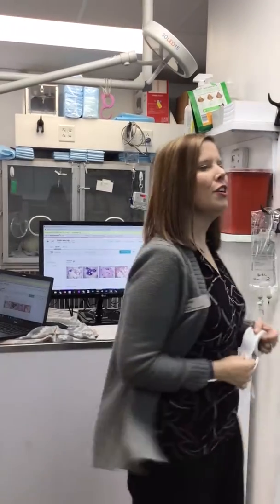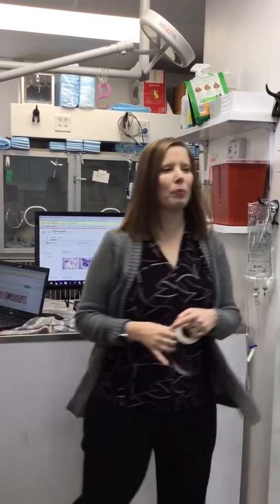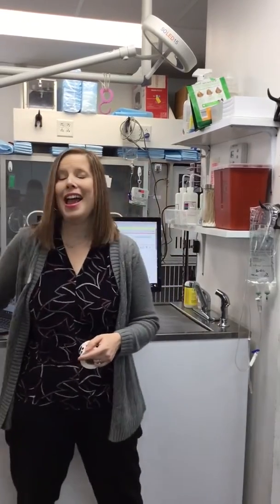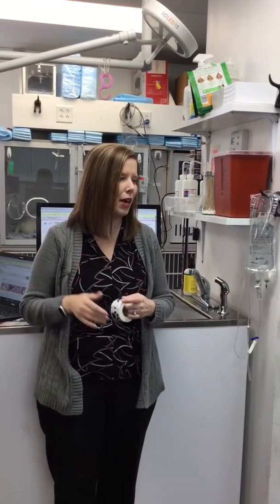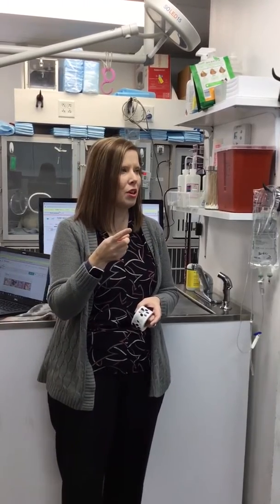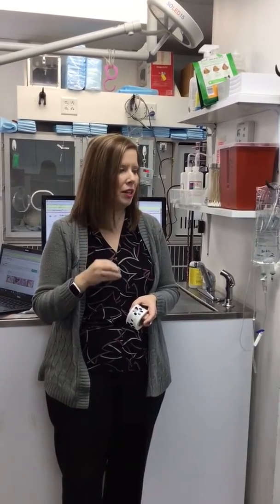So have y'all ever stayed in a hotel? Yeah. Have you ever been on a road trip and you're really tired and you're trying to find a hotel and you keep seeing no vacancy, so you end up having to sleep in your car? Done that before. So think of those whole blood separators as like a hotel. That gel on top is the rooms. So if you put too much blood in there, there's not enough room at the end.